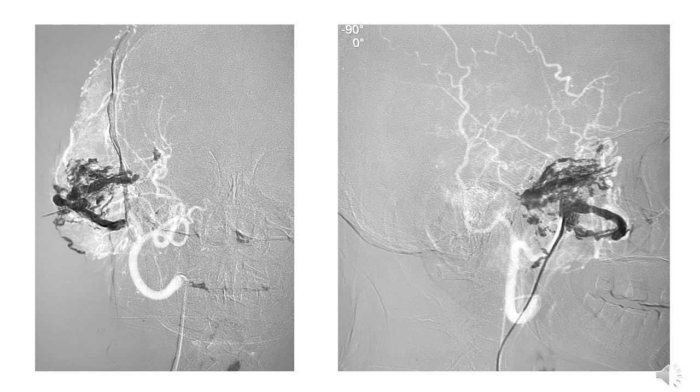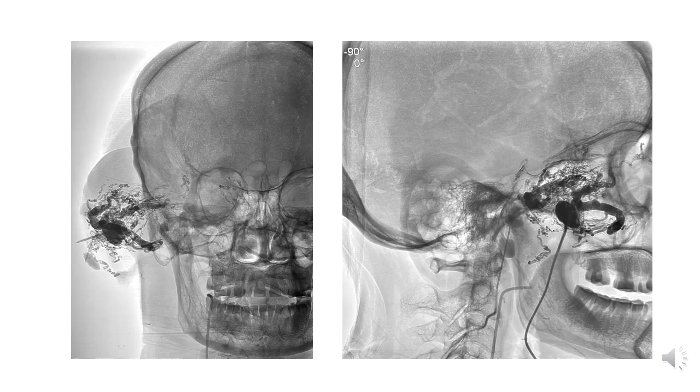So progressively there will be thrombosis and decrease in the parenchymal perfusion using this technique. But obviously this is only the core of the tumor. We still have a large part of the tumor to be embolized. In the fluorospot unsubtracted images, we can see now that there is a globular kind of glue filling at the center, which means that now no more injection can be done from here.